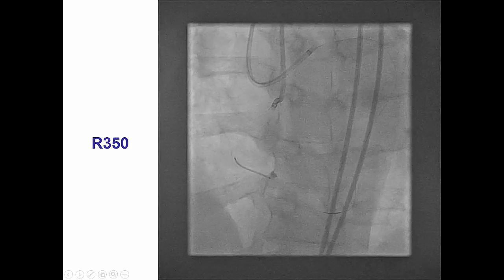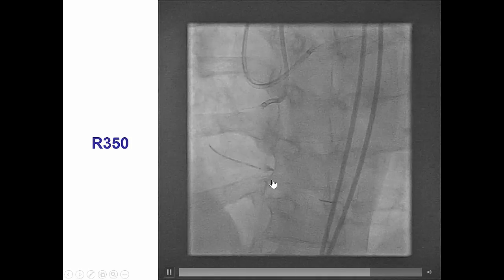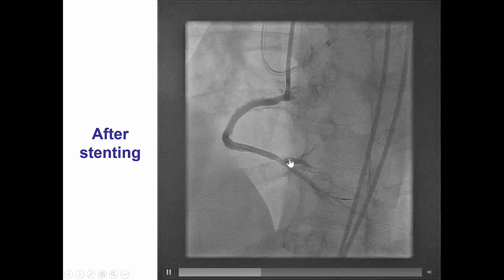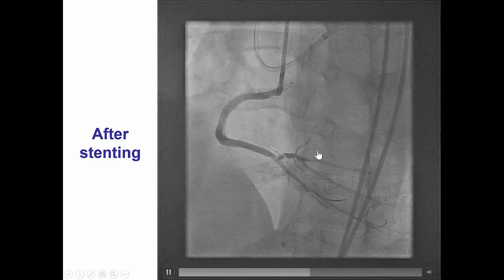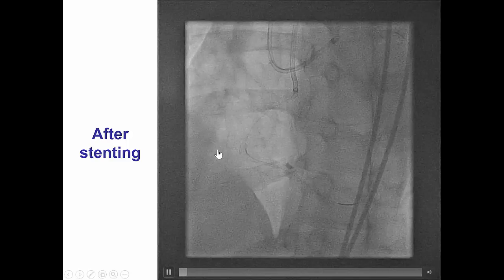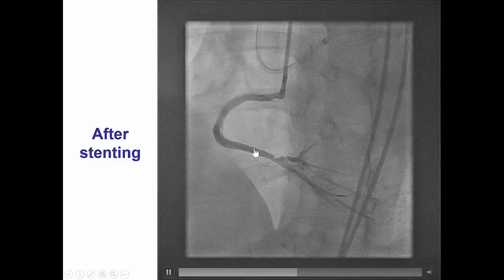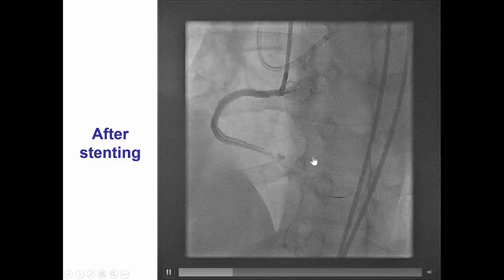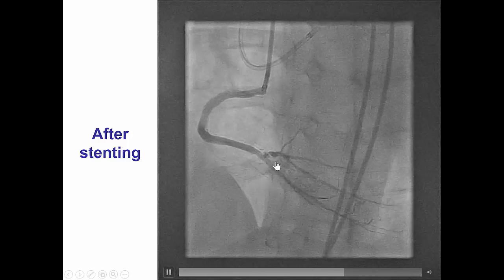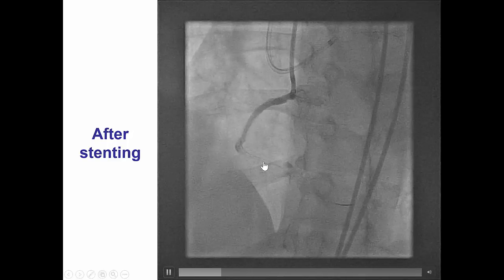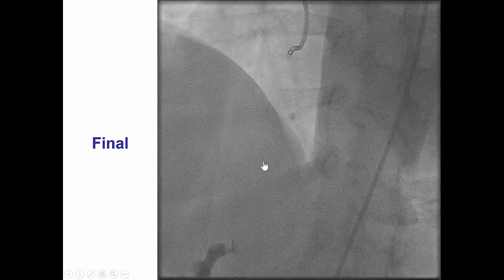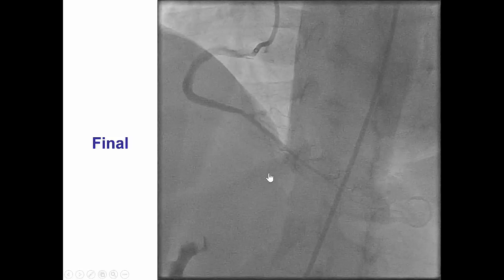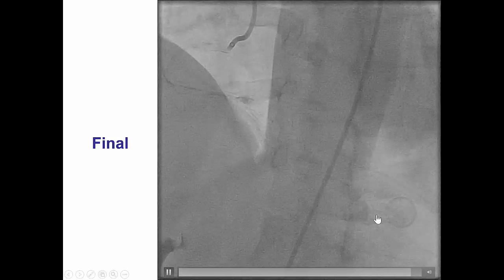We switched to the R350 externalization wire and began stenting from the distal RCA. There is a dissection plane visible at the posterolateral origin. There was still some flow into that area after placing stents in the distal, mid, and proximal right coronary artery. We attempted to wire into the PL branch using a TwinPass catheter, but were unsuccessful, and we achieved TIMI 3 flow into the posterior descending artery.